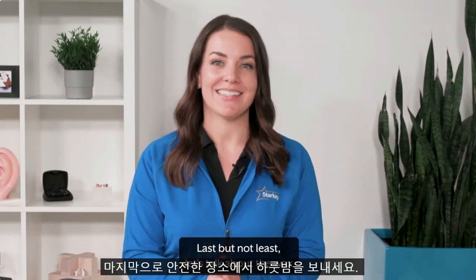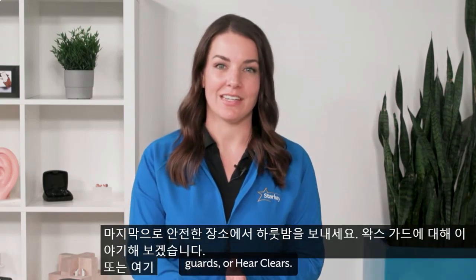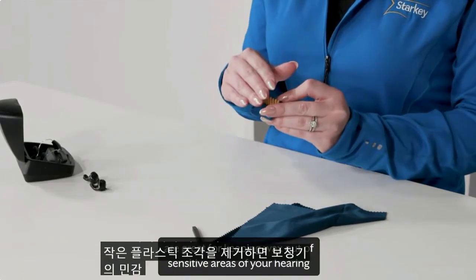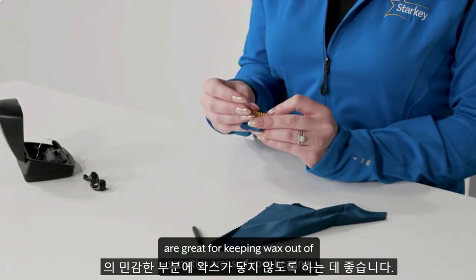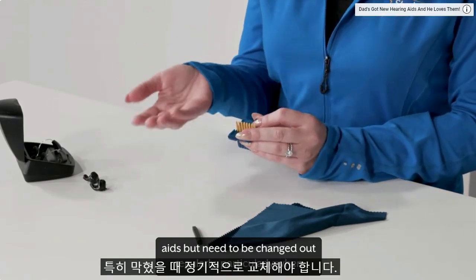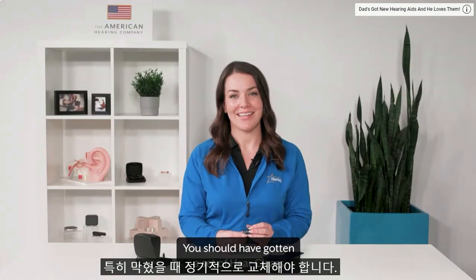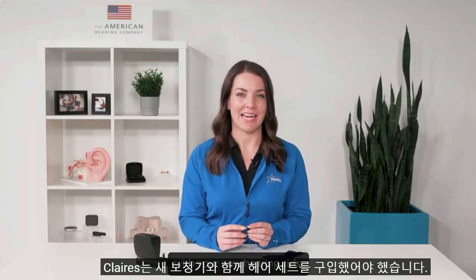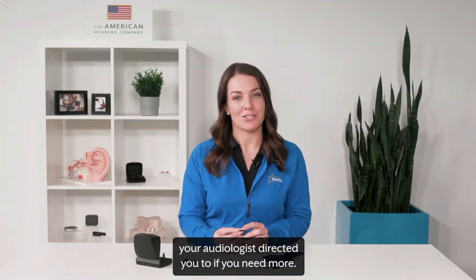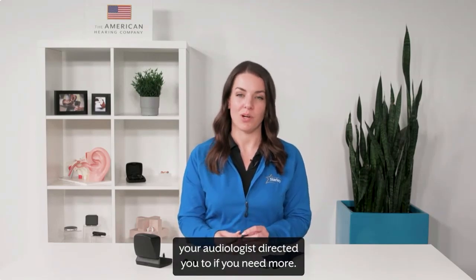Last but not least, let's talk about the wax guards or Hear Clears. These handy little pieces of plastic are great for keeping wax out of sensitive areas of your hearing aids, but need to be changed out regularly, particularly when they get plugged. You should have gotten a set of Hear Clears with your new hearing aids. Reach out to the Denver Logistics Center your audiologist directed you to if you need more.